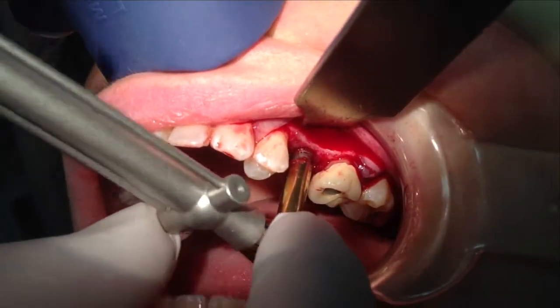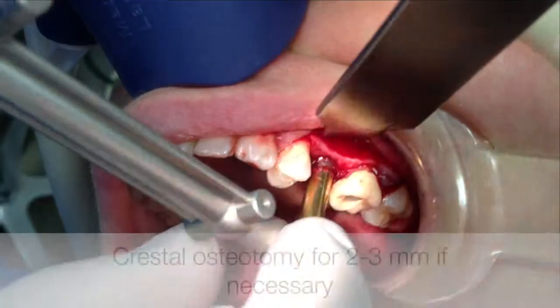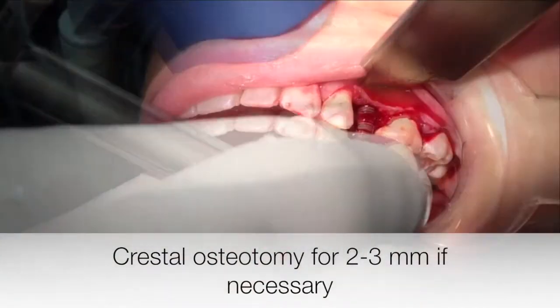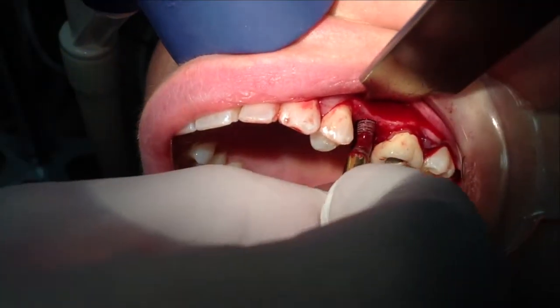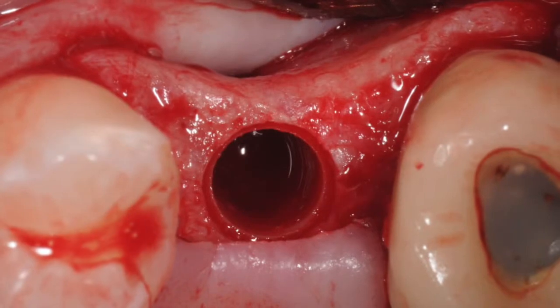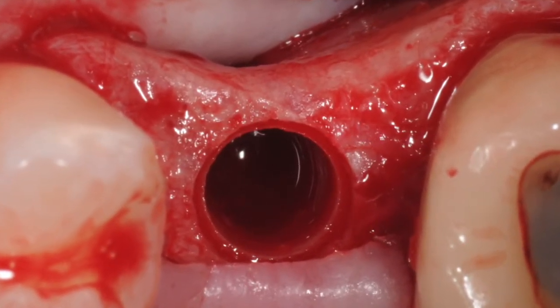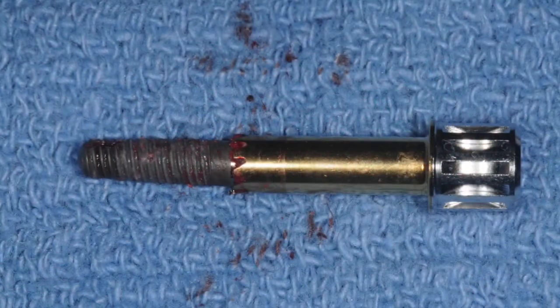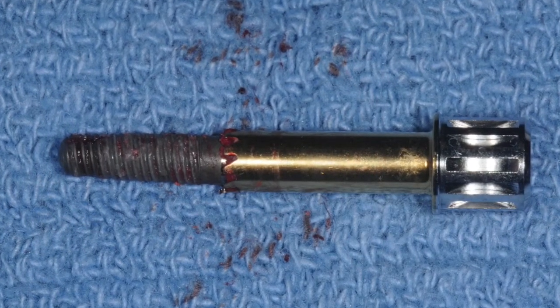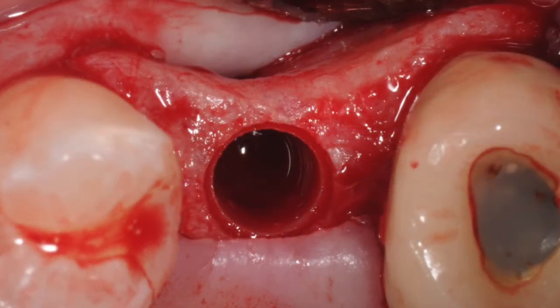If the implant doesn't rotate with this torque, then a minimal osteotomy can be done for about two or three millimeters at the crestal aspect. Then the implant can be reverse torqued again, and this generally successfully reverses the implant. Here is the implant still attached to the removal device, which is then separated. The advantage of this technique is that the bone is preserved quite well.